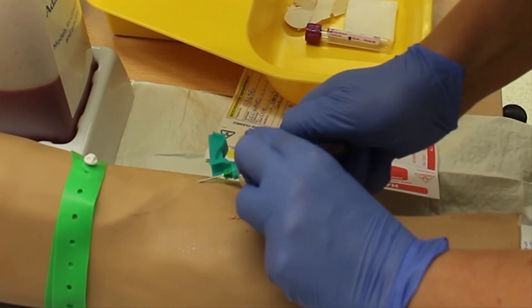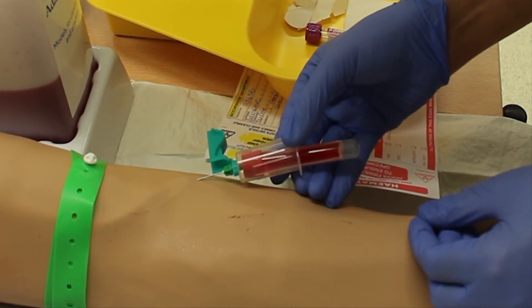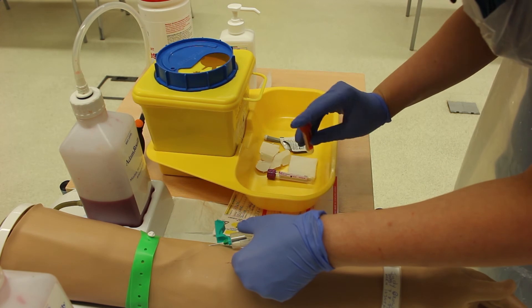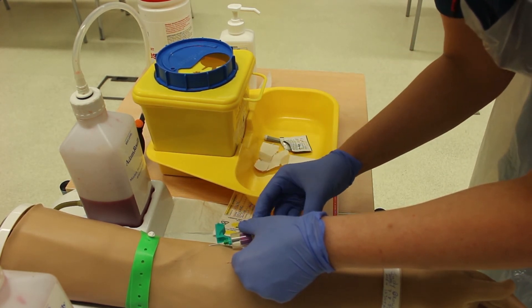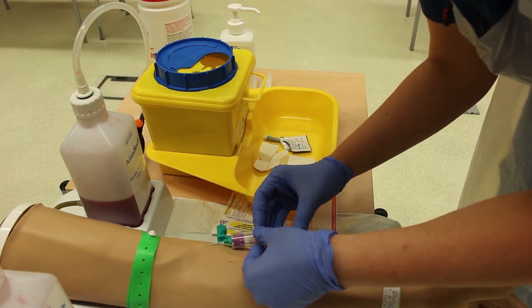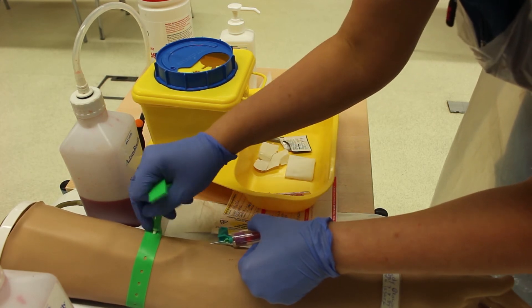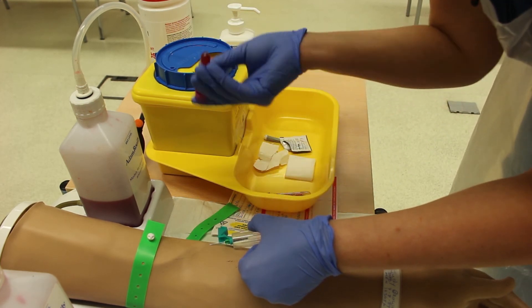I'm inserting the needle at that 10 to 30 degree angle, hopefully feeling a pressure drop, then getting my blood bottles and inserting them — and there's blood return. Take care not to accidentally advance the needle; keep it stable. Once in the vein, lower it to a 10 degree angle. Invert the blood bottles as per local blood collection policy — typically five to six inversions.